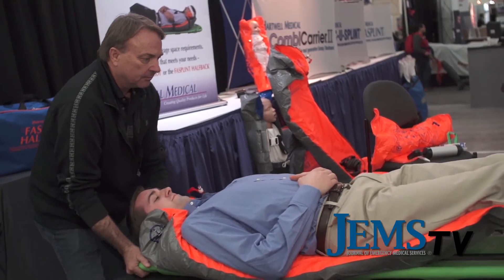What are some of the unique features people really need to pay attention to? It basically immobilizes the patient and places them in the position of comfort, which is really important right now. When used in conjunction with the Combi Carrier, there's the least amount of patient movement — we're getting back to not log-rolling the patient. There's also a lot of buzz about whether a cervical collar is really needed, and by using one of our vacuum products, medics can actually stabilize the patient's head and neck, so many medical directors can see where they wouldn't have to use a cervical collar at all.